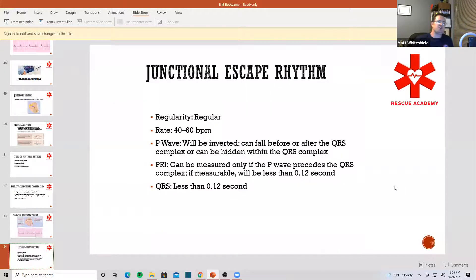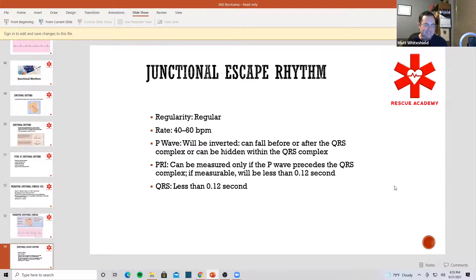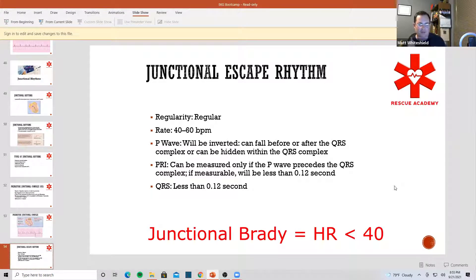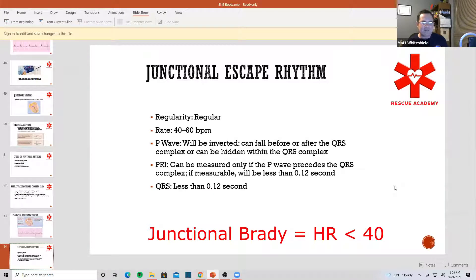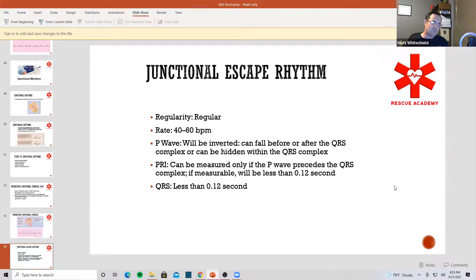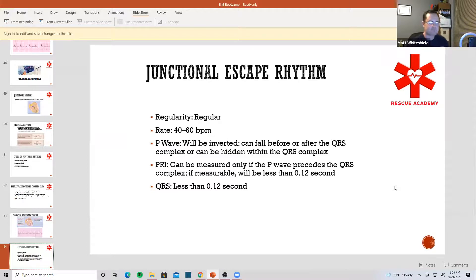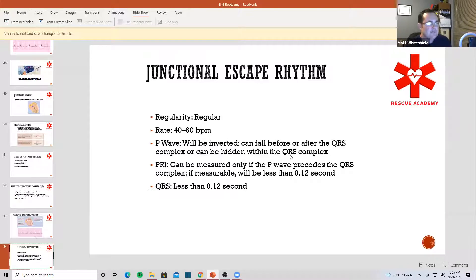Now let's talk about junctional escape. Whenever we talk about junctional escape, it's all dependent on rate. Rate is going to tell you if we have junctional brady, a junctional escape, accelerated junctional, or junctional tach. It's called junctional because it's from the AV junction — the answer is yes, that is what they call it for.